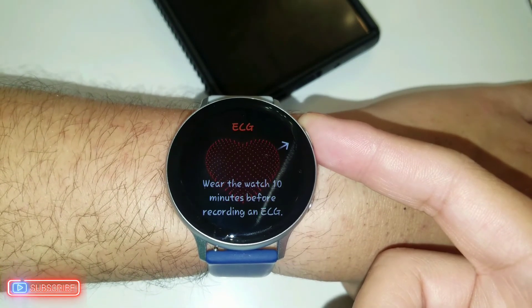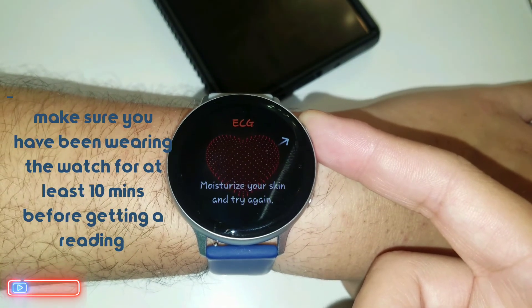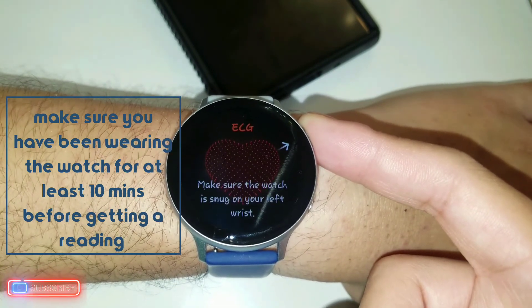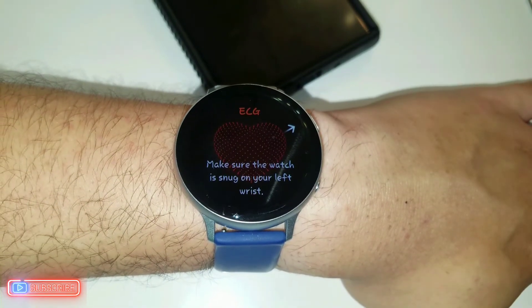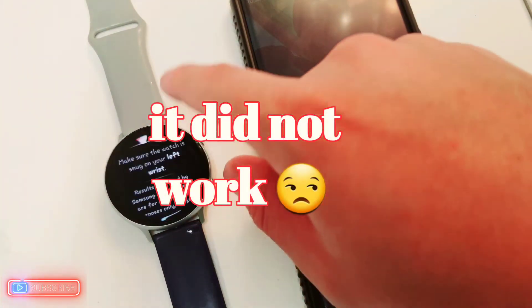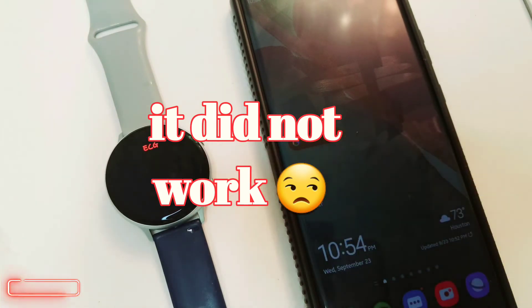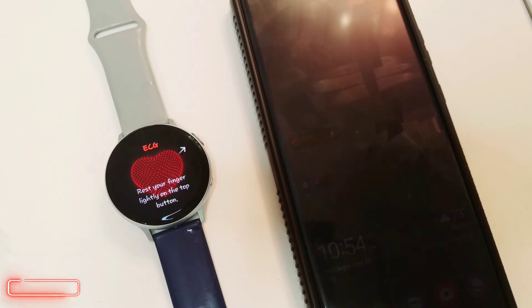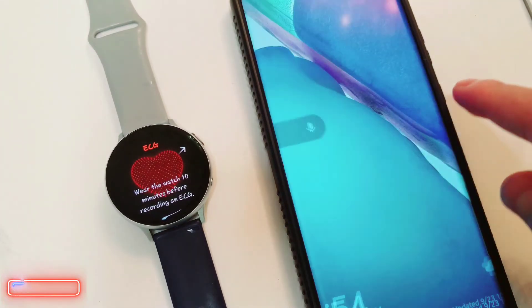It says to wear the watch 10 minutes before getting an ECG, so I'm going to wait and see what happens. One hour later — I'm trying to get a good reading on the ECG with the new app after the update, but for some reason I'm not able to get a good read. I was wearing the watch for probably 40 to 50 minutes after it said you need at least 10 minutes — I did that and it didn't work for me.